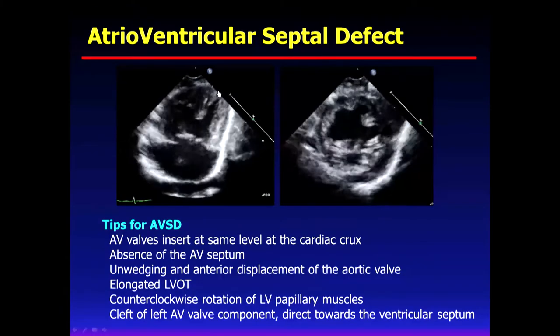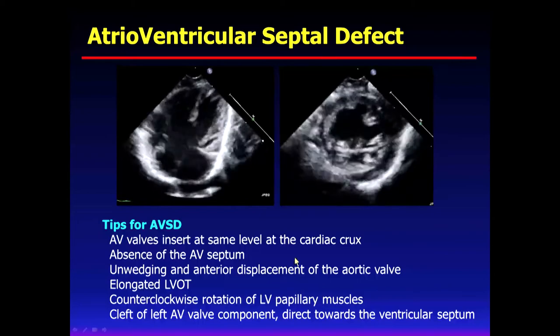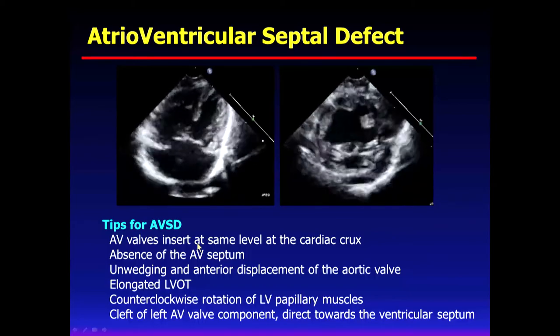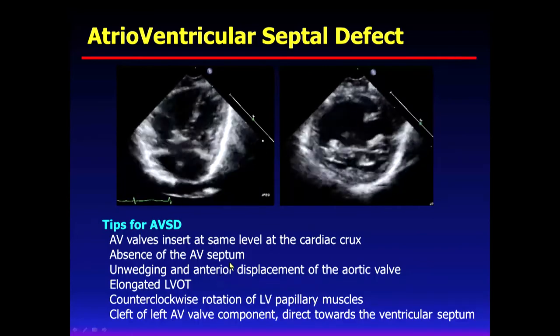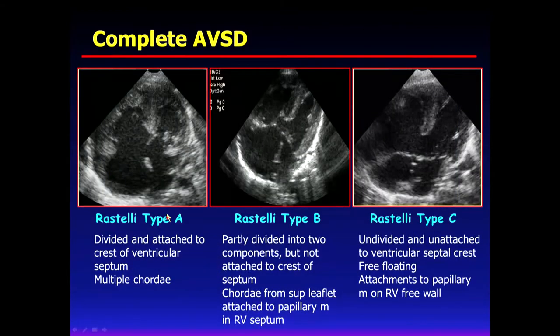And this is a very, very ugly shape. We call that complete atrioventricular septal defect. All the time, the atrioventricular septum has a deficiency, and then the valve inserts at the same level at the cardiac crux, but normally, the tricuspid valve should be placed towards the apex. So this is different, and there is unwedging and anterior displacement of the aortic valve, so the aorta is located a little anteriorly, so the LV outflow tract is longer than normal. And the cleft is found usually. So for complete AVSD, we call the Rastelli type A, B, C, divided because we need to look at whether this is possible for biventricular repair or not.